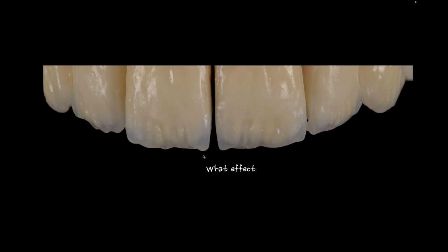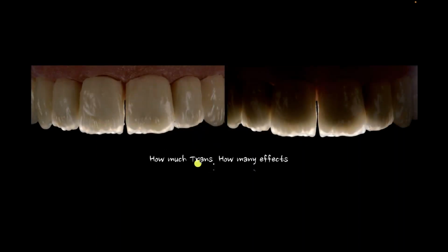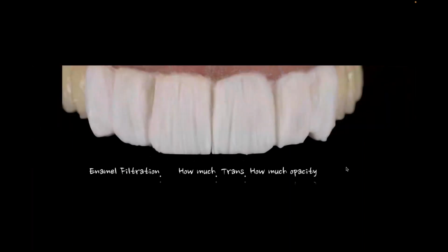And that's the effect that I use with either mamelons, effect chromas, and if I'm in Lumix, it might be a flow dentin or a mamelon material. It really depends on the system that I'm working in. But the goal is to decide how much translucency I am trying to create in that specific case for that specific person. Once I've done that, the next concept, and I've touched on this in some of the layering webinars, is how much filtration do I want to apply over that?